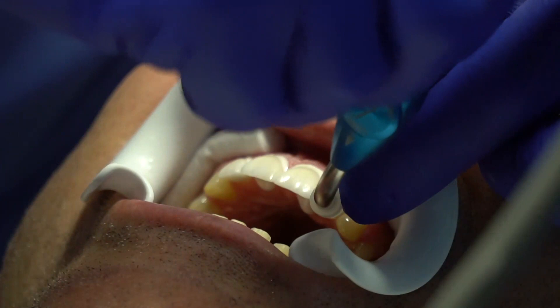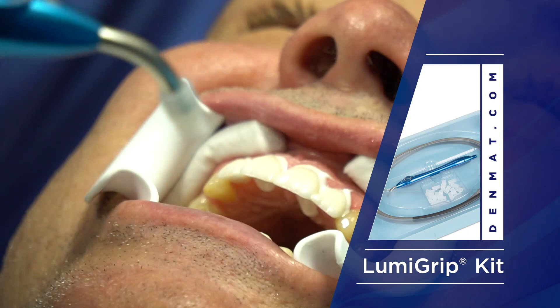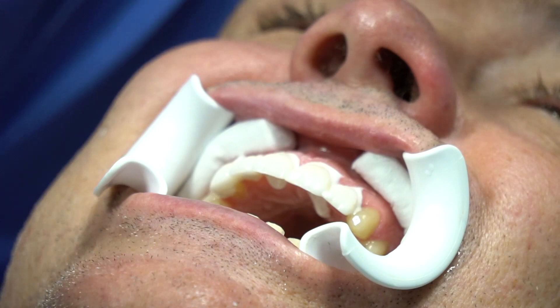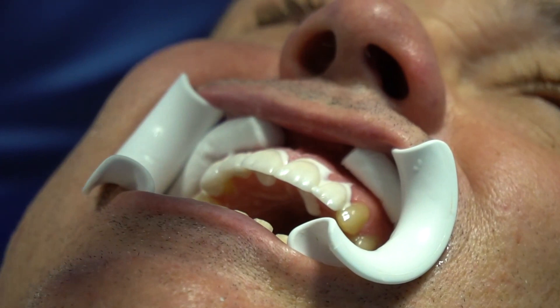This is called a Lumi Grip — this thing is fantastic. Dennis Wells, the no-prep guy, says you have to have a Lumi Grip if you do minimum prep veneers. He's a big advocate of it. If you do a lot of CEREC inlays and onlays, this also works great for seating them.